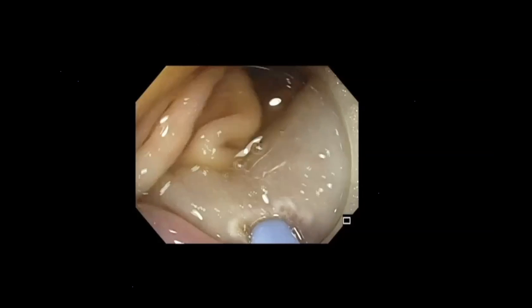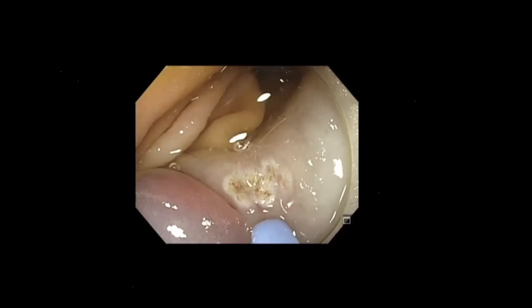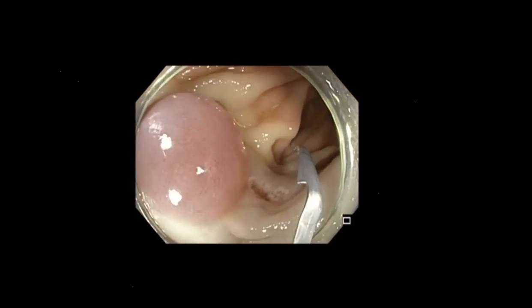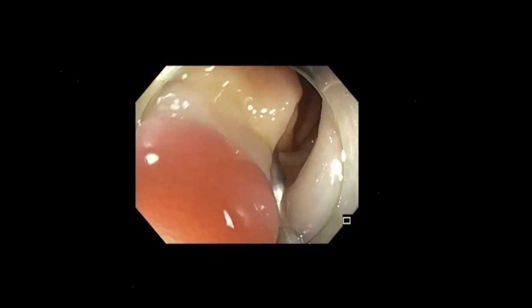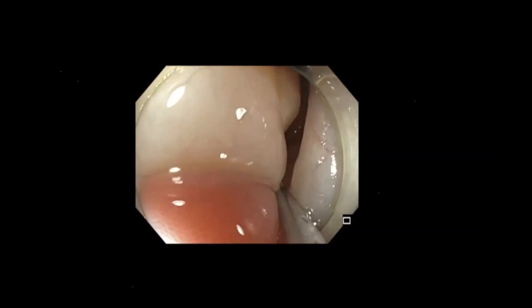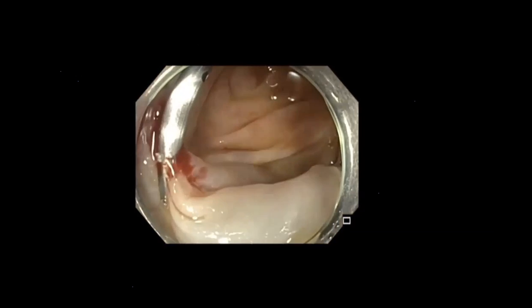So after every application, I'm seeing what's the effect. After this, I went ahead and actually clipped that area. You may wonder, why the heck did you clip? As mentioned earlier, I wanted to limit any delayed effects, although my treatment was very, very superficial. I was concerned about her. She was in her 80s.